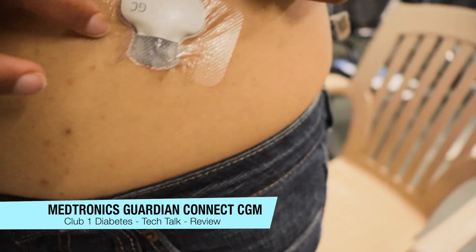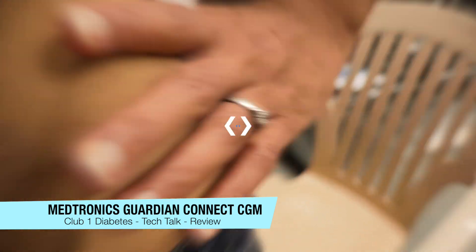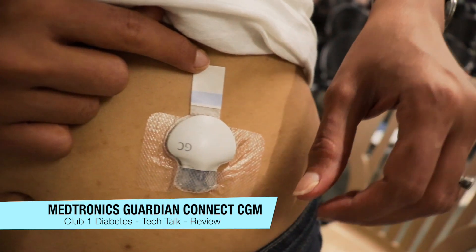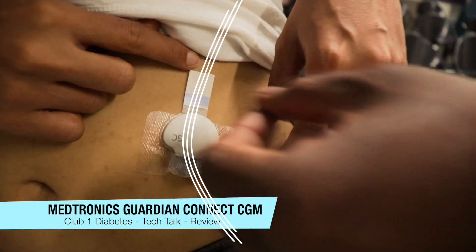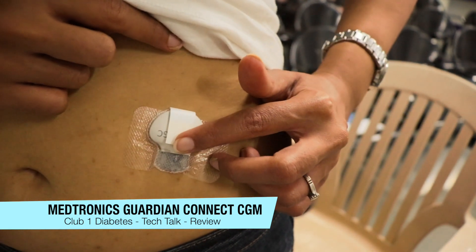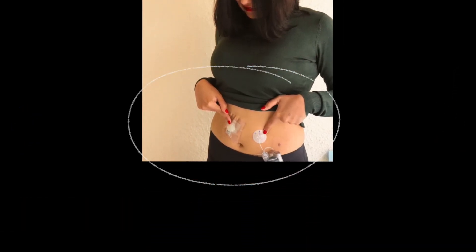You've probably seen it already. Once the light blinks, you know you're all set and good to go — you've just got to tape it on now and make sure it stays securely on your skin. The transmitter is a pretty important part in this whole scheme of things because it's the device that relays your blood sugar from your sensor to your phone.